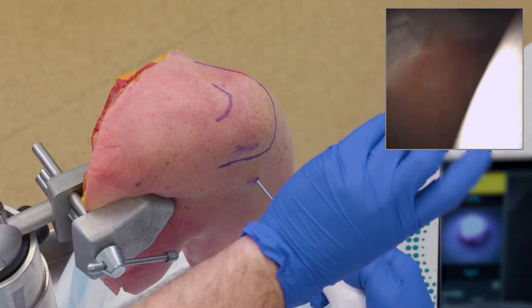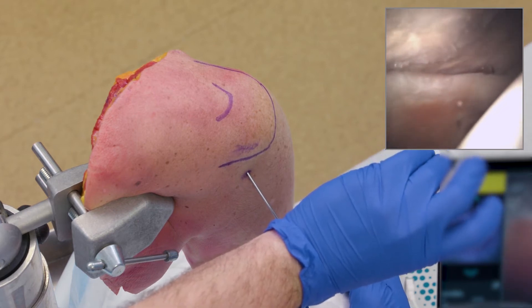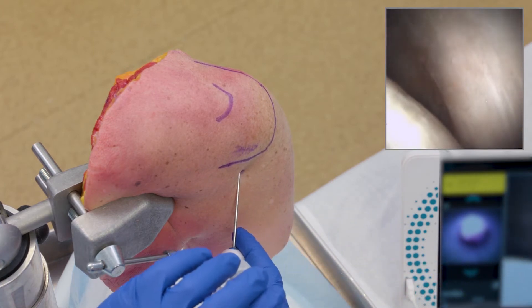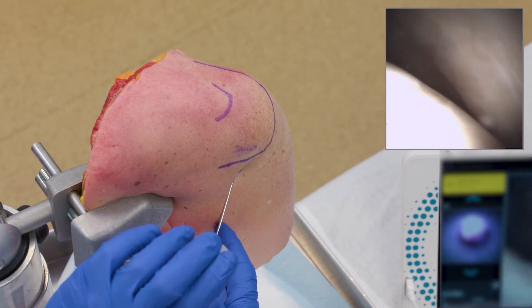It gives me a visualization immediately inside the joint. Here we get a really good view of my humeral head, my glenoid to the left of my screen with some soft tissue, and I can look at my rotator cuff coming atop and attaching to my humeral head. This is all without moving the patient's arm — their arm is just at their side and they're comfortable.